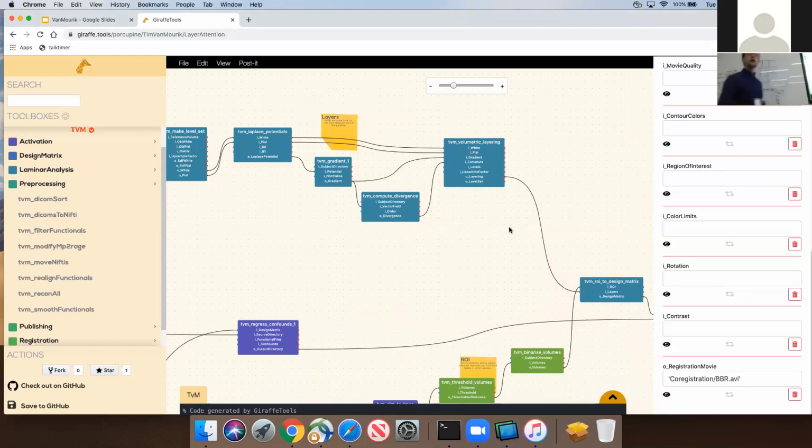Having said that, I do think this is a very interesting way of looking at the same problem, as opposed to the classic way of just interpolating along a line. It also goes back to one of the questions we had this morning about nominal resolution. Cheryl, what came out of that little list of nominal resolutions? How did people like to define it? The problems with any true resolution or nominal?